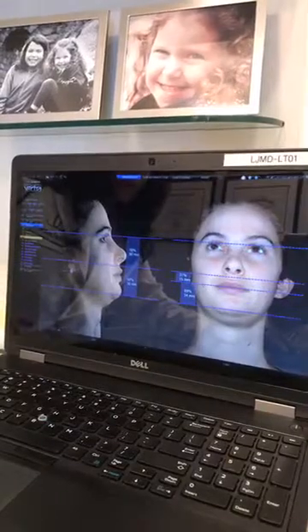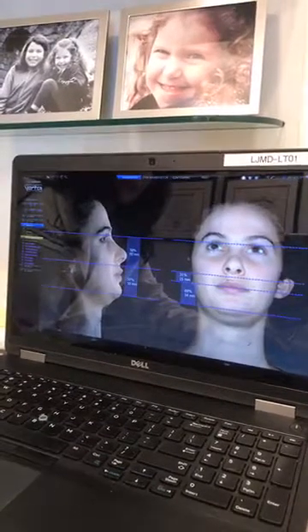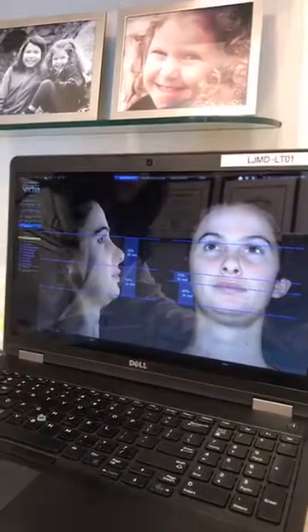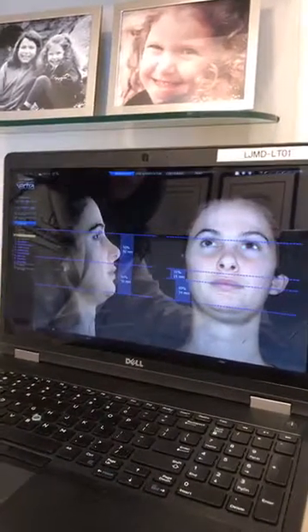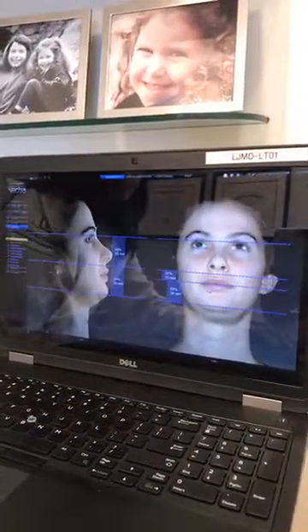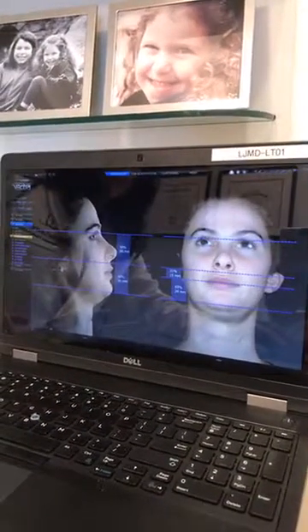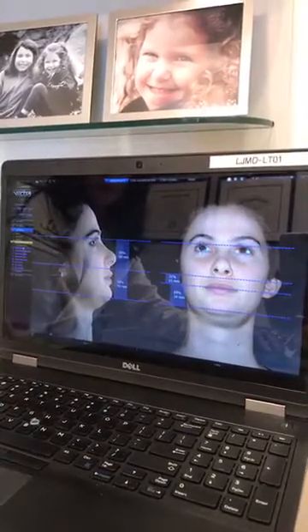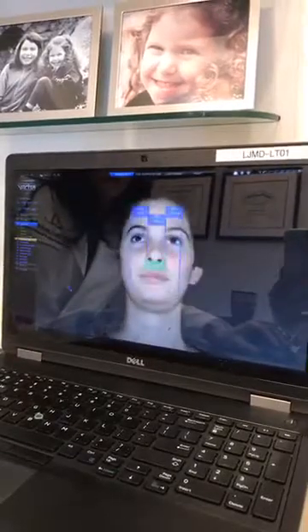What is also really important here is that the distance between the base of the nose and the upper and lower lip should be about one third to two thirds, which Kristen has fairly close to. That shows us these are close to ideal facial proportions, and how pretty Kristen really is.